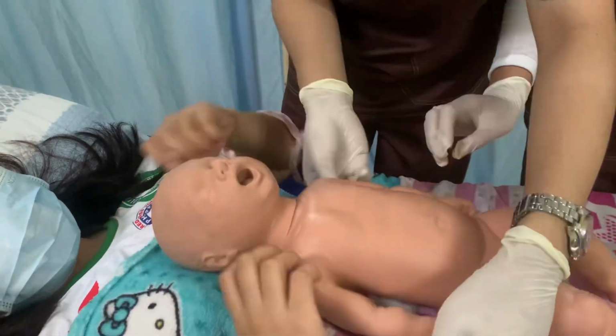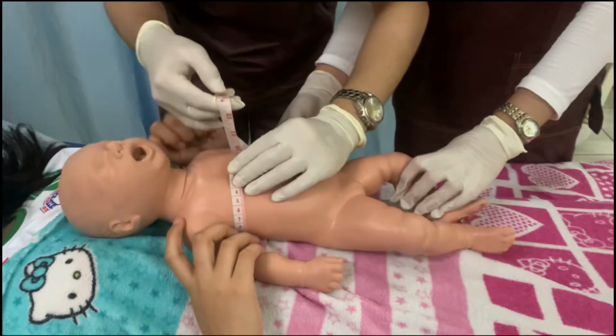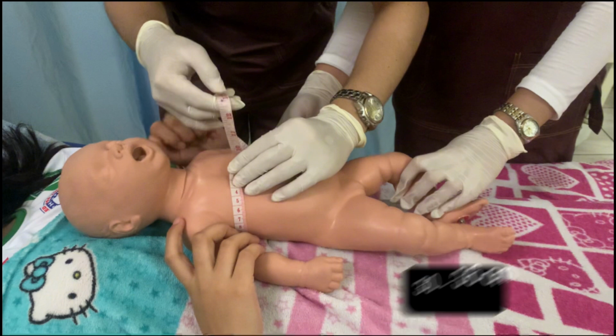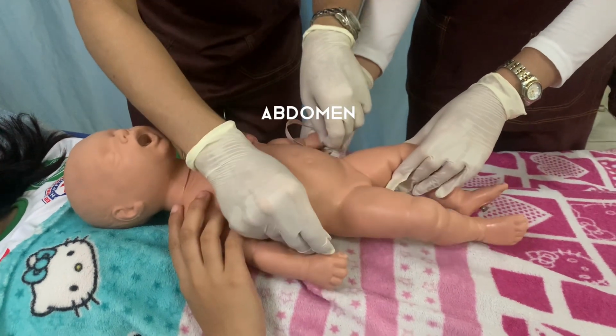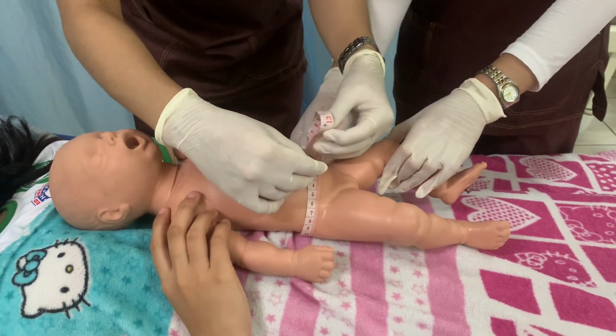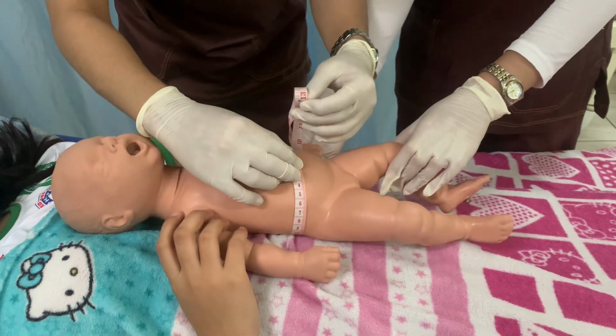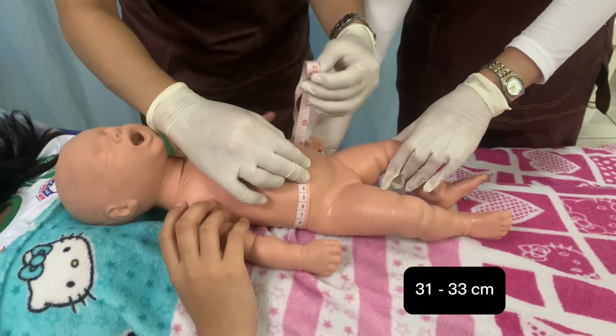For the chest circumference, wrap the measuring tape around the infant's chest and use the nipple line as a guide. The chest circumference should be about 1 to 2 centimeters less than the head circumference. It should normally be 30 to 36 centimeters. For the abdominal circumference, place the measuring tape around the abdomen of the newborn at the umbilicus line or above the umbilicus, and it should normally be around 31 to 33 centimeters.